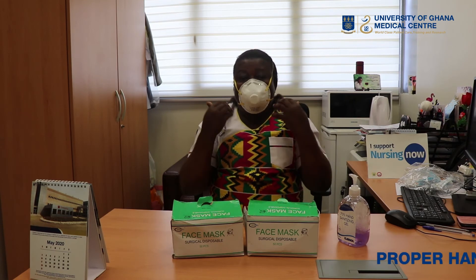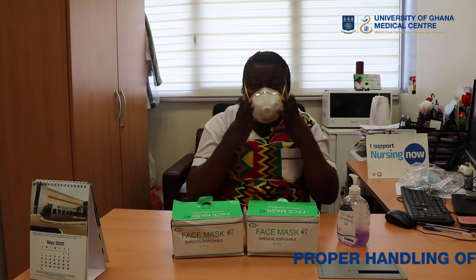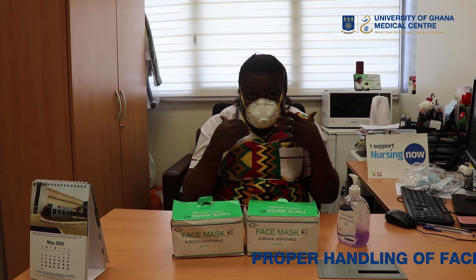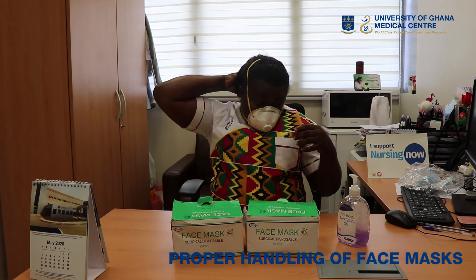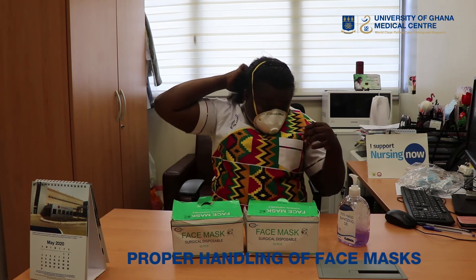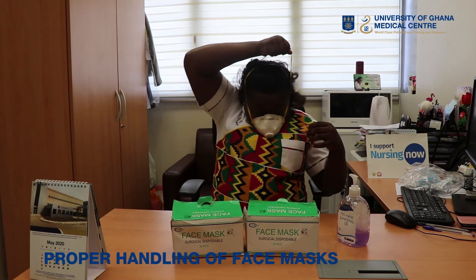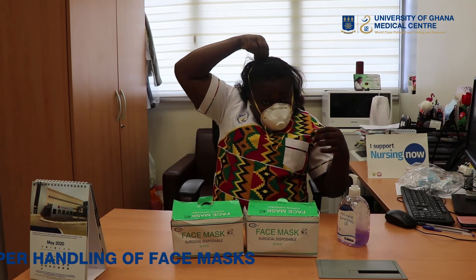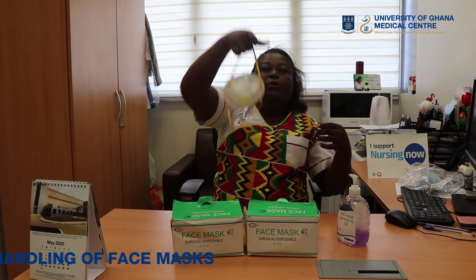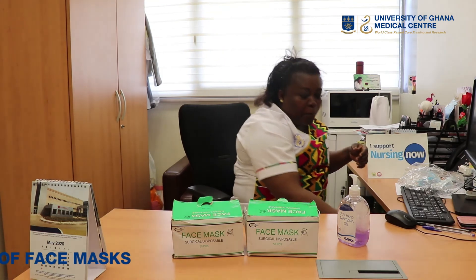In removing the N95, we do it the same — we are not going to touch any parts of the mask. You just tilt your head forward a little bit, then hold the first loop like this and bring it off. Then take the last one and hold it like this, and drop it into the appropriate bin.